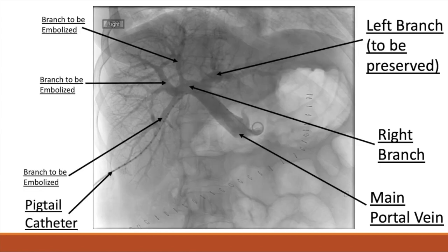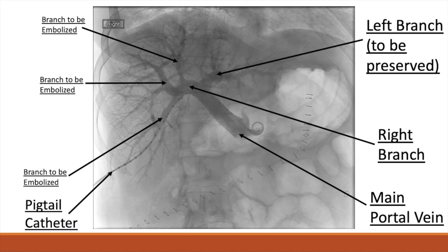A transitional dilator system such as AccuStick is used to transition from a 0.018 wire to a 0.035 wire. Once this wire is in place, we exchange the transitional dilator system for a 6 French vascular sheath and then place a 5 French pigtail catheter. The purpose of this catheter is portal venography, performed to assess portal venous anatomy and identify portal vein branches to embolize or spare. In this image, we see the pigtail catheter leaving the vascular sheath and traversing the right branch of the portal system to enter the main portal vein, from which contrast is released to flow into the portal system.